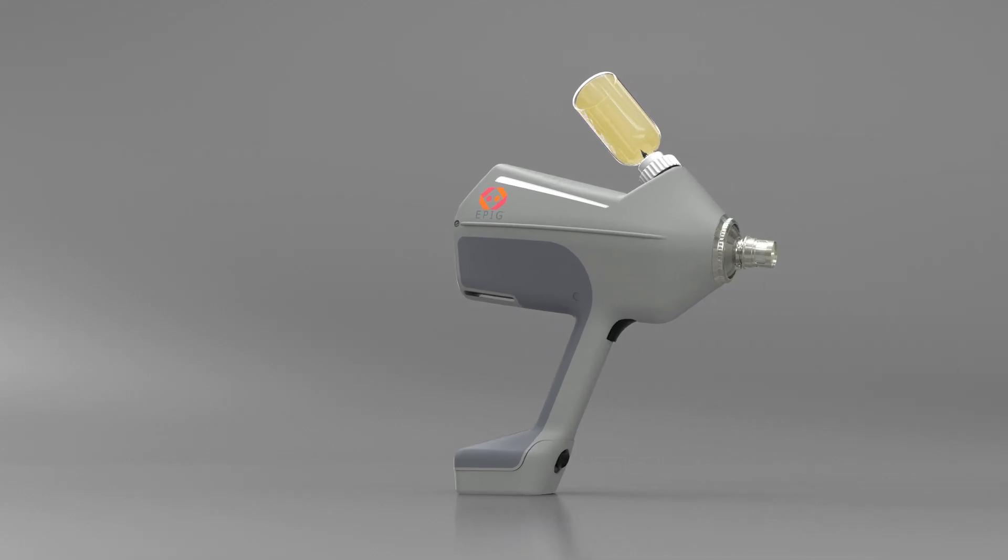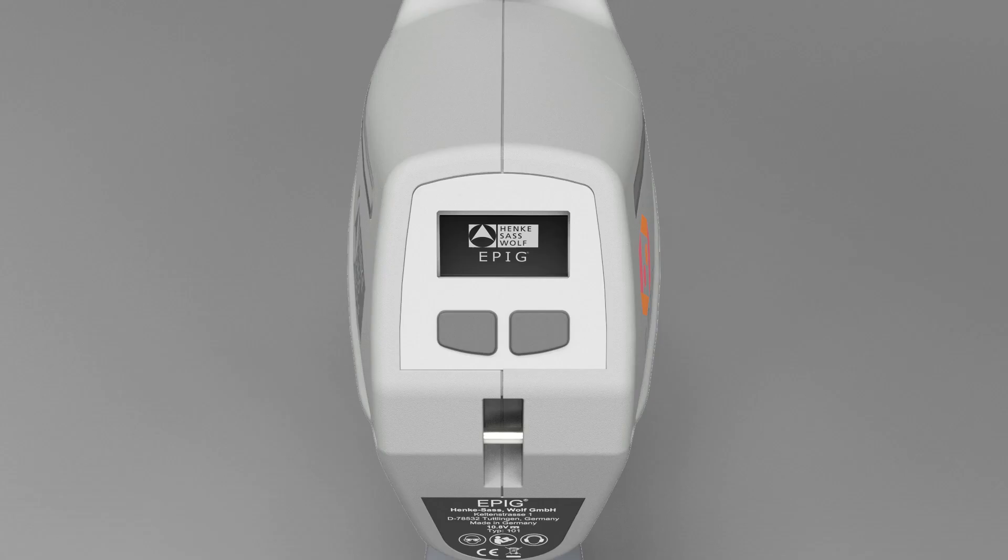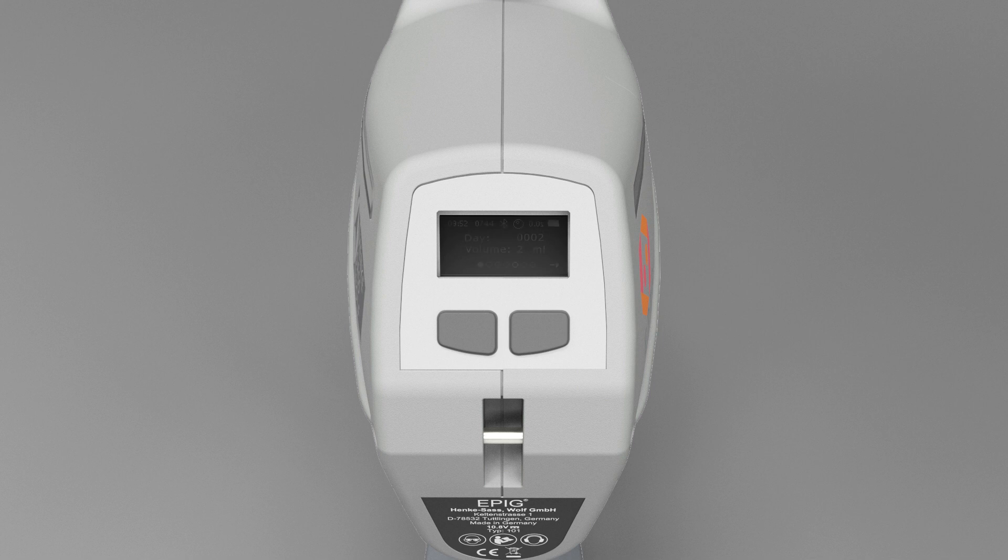The initial display of the user menu will show the most relevant information. The dots at the bottom of the screen indicate the current menu page.